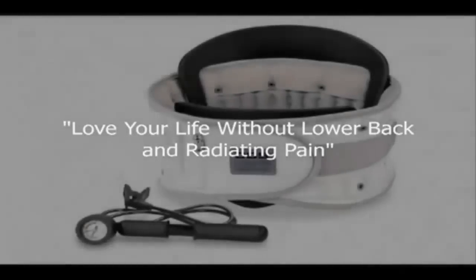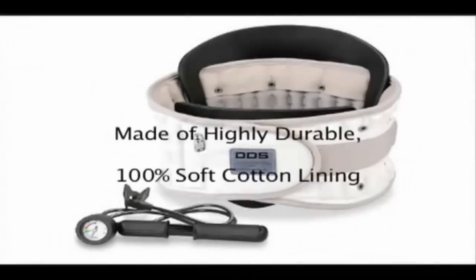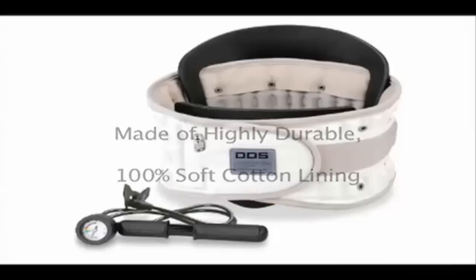So that you can love your life without lower back and radiating pain. The Back Traction Belt is made of highly durable, 100% soft cotton lining, and can be worn discreetly under clothing.